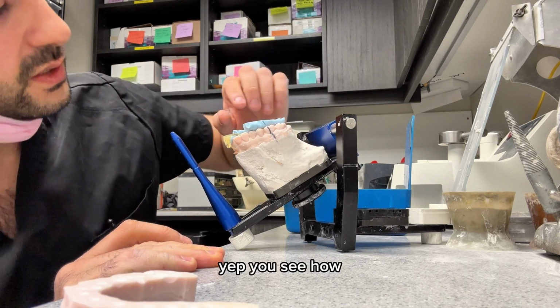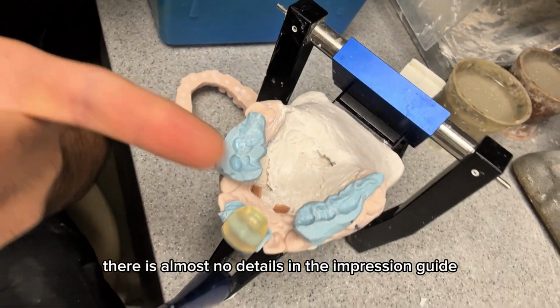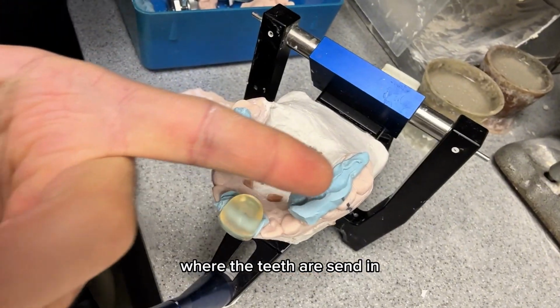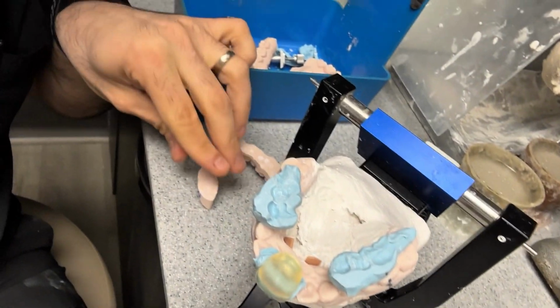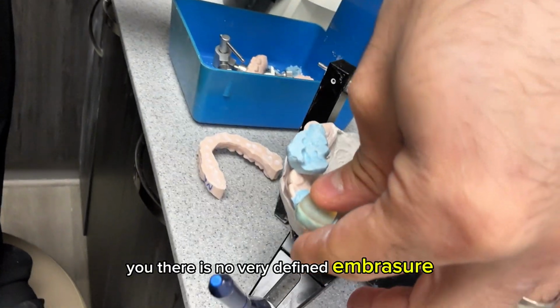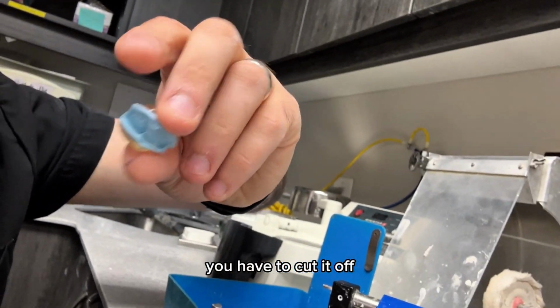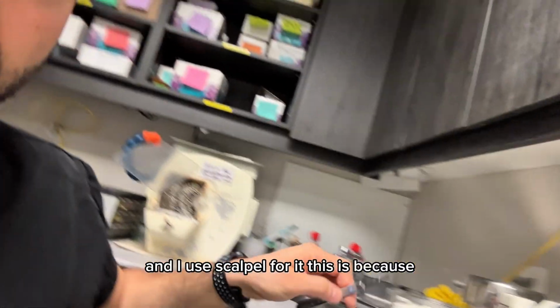Yep. You see how there is almost no detail in the impression guide where the teeth are setting in. And I'm going to demonstrate to you. There is no very defined embrasure. You have to cut it off, and I use a scalpel for it.